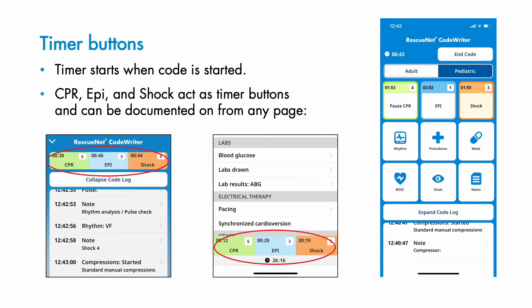The CPR timer flashes if activated for longer than two minutes or if CPR has been paused for more than 10 seconds. The Epi timer begins to flash at the three-minute mark and also displays the number of doses of epinephrine recorded as administered. The shock button displays the time since the last shock was delivered and the number of shocks recorded.